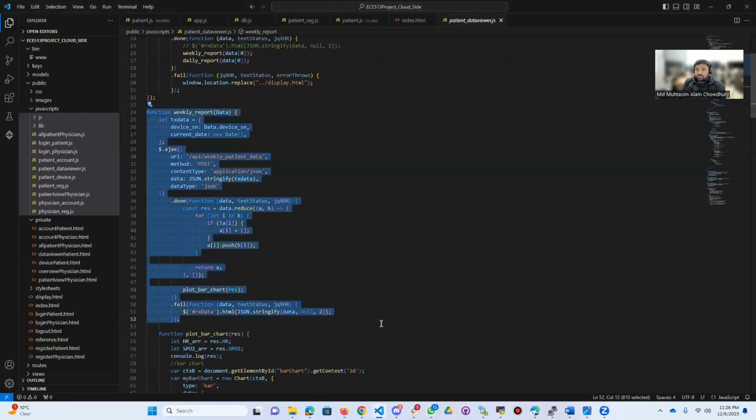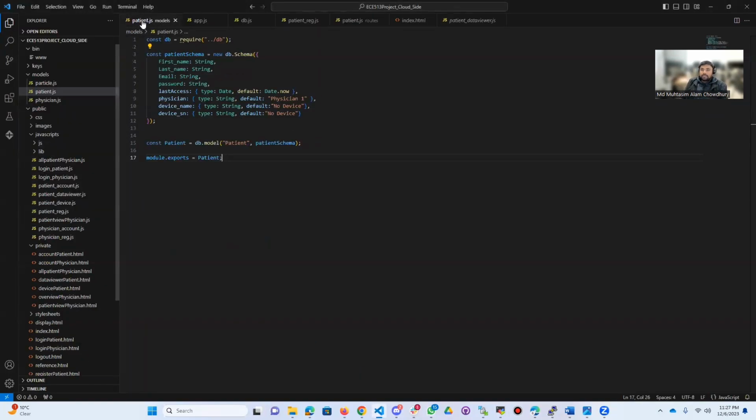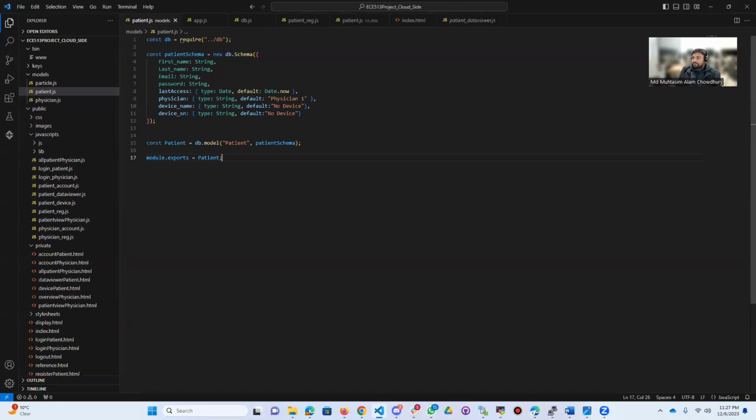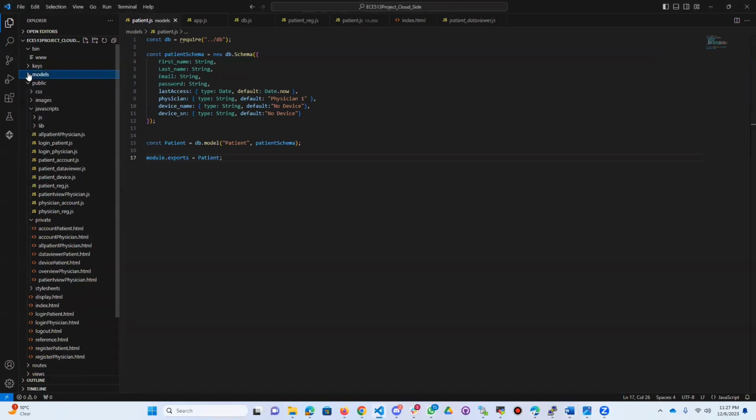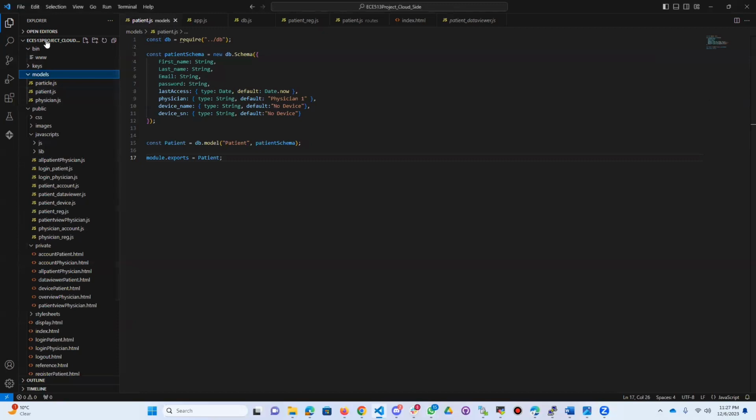You go to VS Code, and I have the code here, as you can see. So let me start showing you the whole thing. As you can see here on the left side, I have loaded my project in this software, and in the module you can see the three things: physician, patient, and particle.